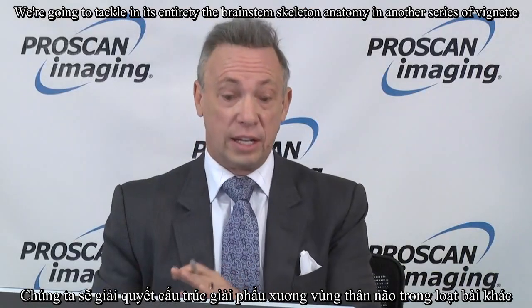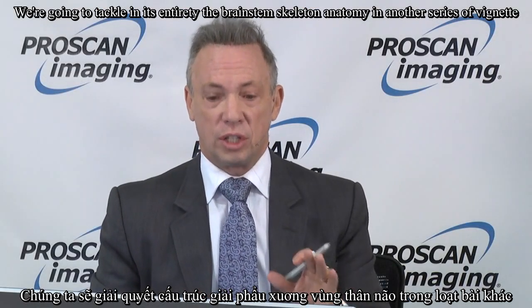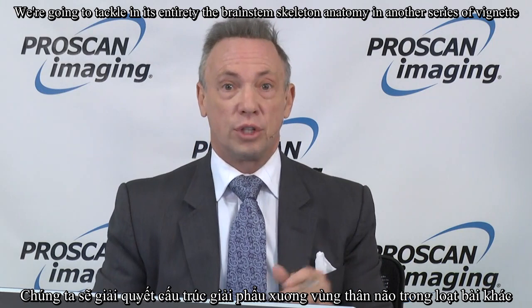We're going to tackle in its entirety the brainstem skeletal anatomy in another series of vignettes.